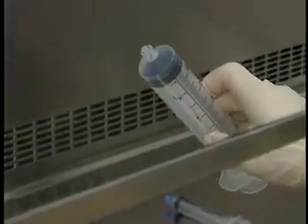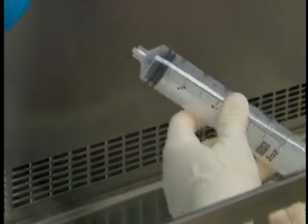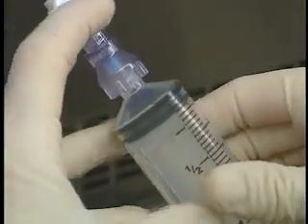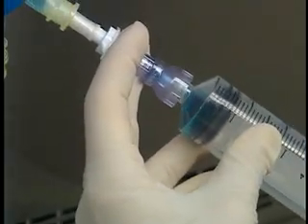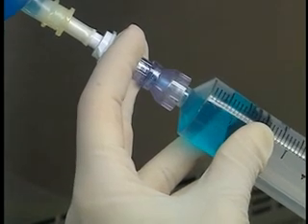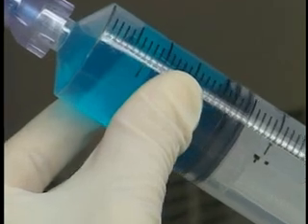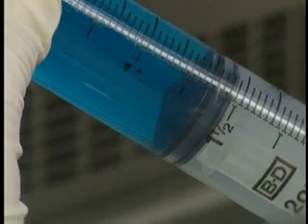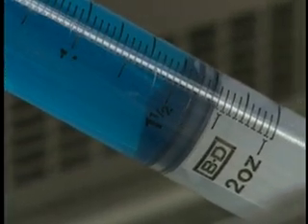Expel the air from the syringe and then remove the tip cap if there is one. Attach the syringe to the transfer device. Withdraw the desired volume, working at an angle of 70 degrees and taking care not to obstruct the laminar airflow. Draw in a little extra fluid to fill the space occupied by the air bubble and, if appropriate, to compensate for the volume contained in the needle.